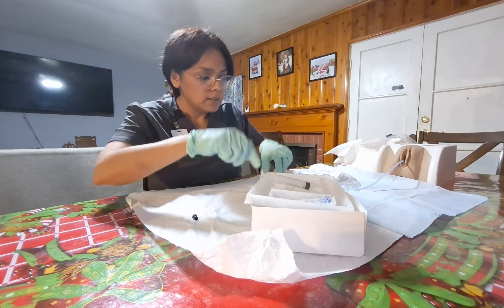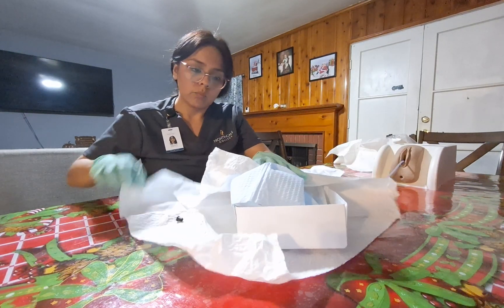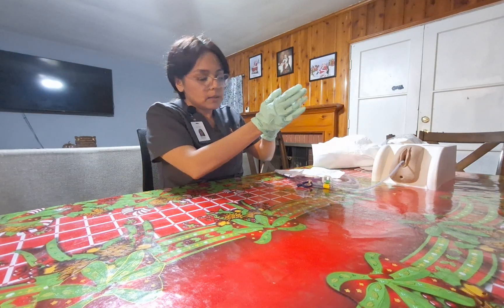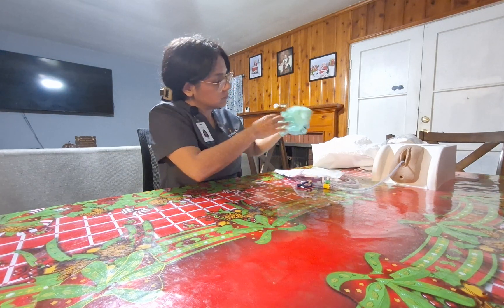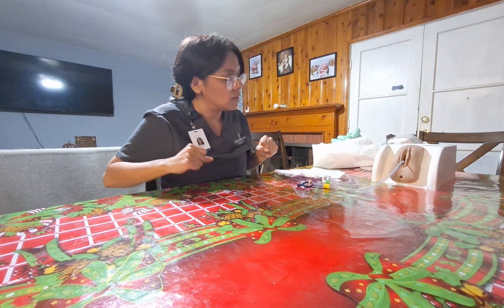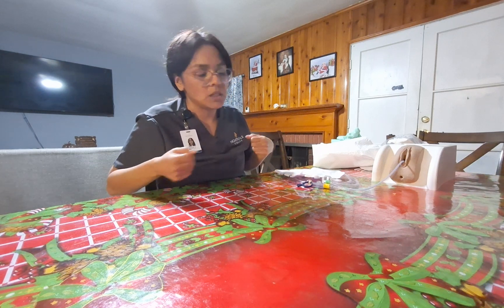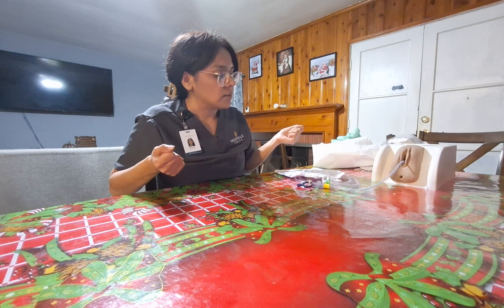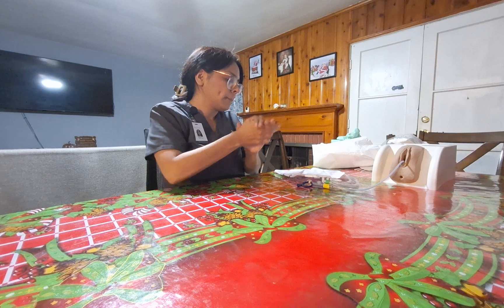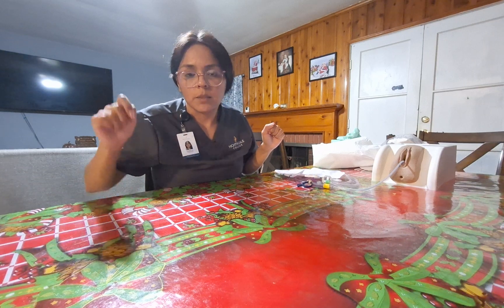I will clean up the supplies and throw them into the receptacle, then throw away my gloves. Mrs. Garcia, is there anything else I can do for you? Do you feel comfortable? The call light is right here next to you — please go ahead and call me if you have any questions or feel any discomfort. I'm going to perform hand hygiene and I'll be checking on you every few hours. I'll go back to the nurse's desk and document this procedure.